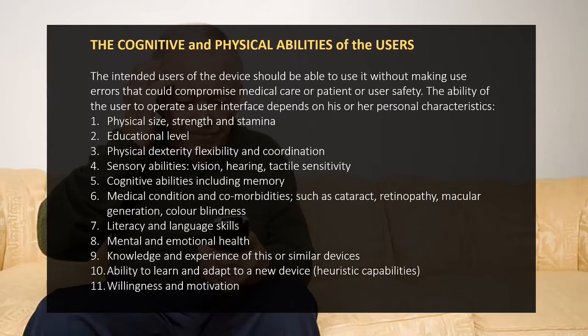I was involved with a project a while ago where it was a device that people carried portably, which actually was attached to the ascending aorta of your heart. It was an intrusive device. We had to very carefully consider what it was going to be like for the person out in the community and create sounds that reassured them that the device was still on, but didn't reinforce and make them feel worse that they were gravely ill.